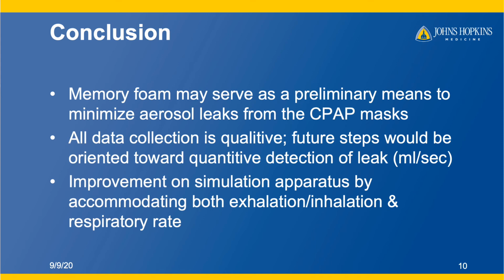To summarize, from our preliminary study, we first determined that memory foam may serve as a preliminary means to minimize and reduce aerosol leaks from CPAP masks. Our study provides an important first insight on how we can adopt a pre-existing NIV CPAP therapy in providing better respiratory care for COVID-19 patients.